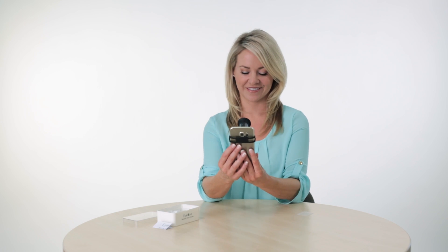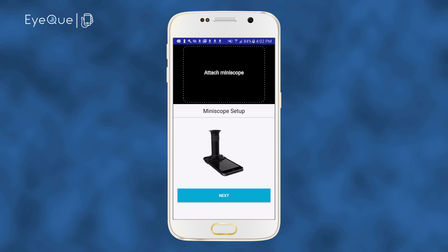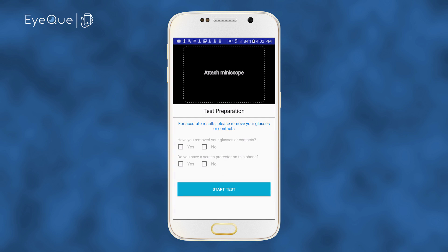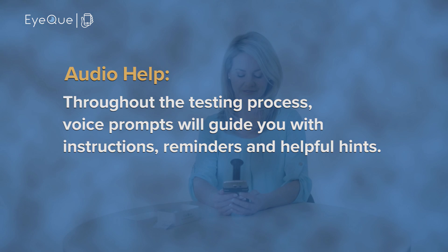It's not an adhesive and it will not leave any residue or marks on your phone's screen. Make sure that the IQ logo is facing the bottom of your phone. Next, secure the mini-scope to your phone by attaching the supplied elastic band. Now that the mini-scope is securely attached, make sure the rotating eyepiece is set to Position 1, then click the Next button.